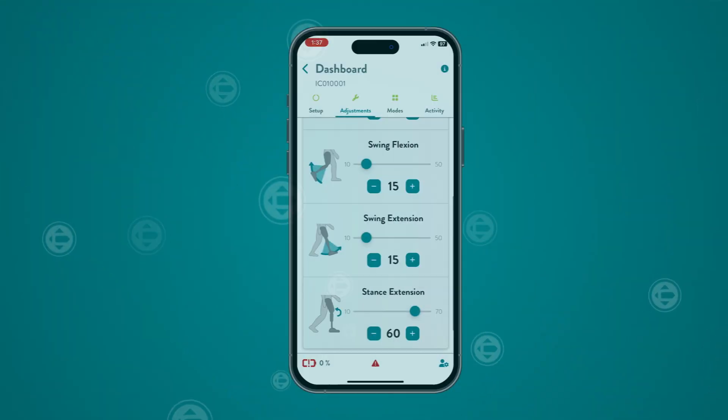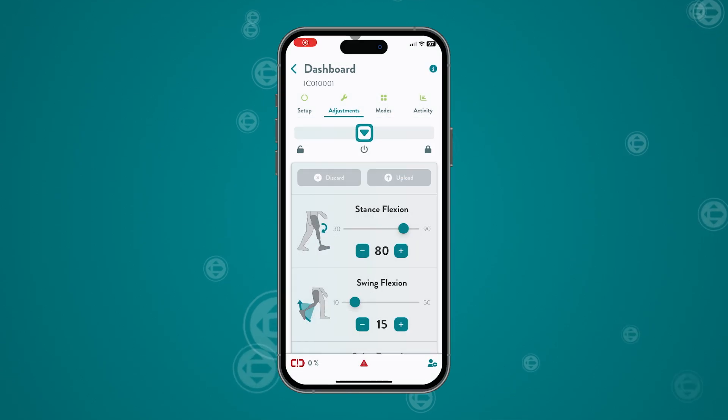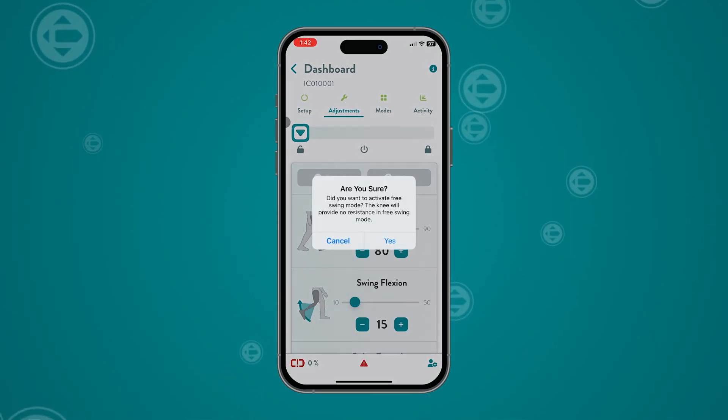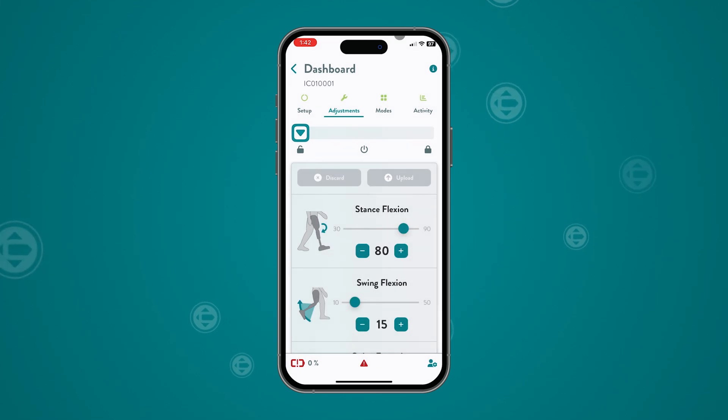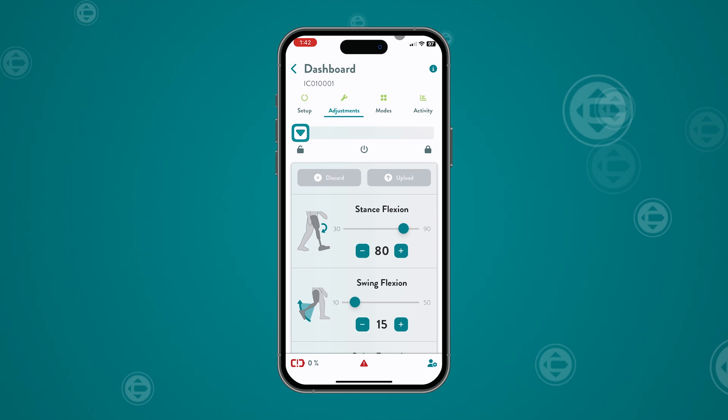We recommend that you take a screenshot of the knee's resistance settings for future reference. The mode selector allows you to change between normal walking and lock mode, or normal and free swing mode. Both the prosthetist version of the app and the user version can access the mode selector.